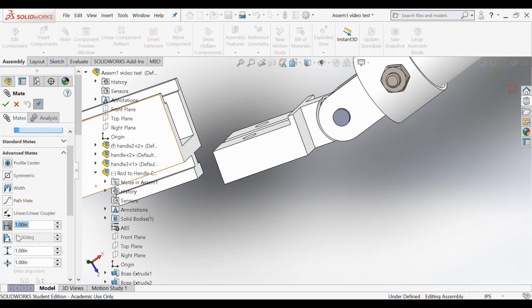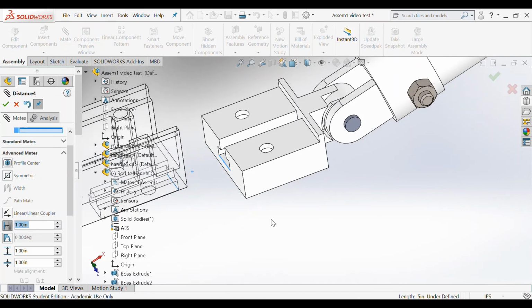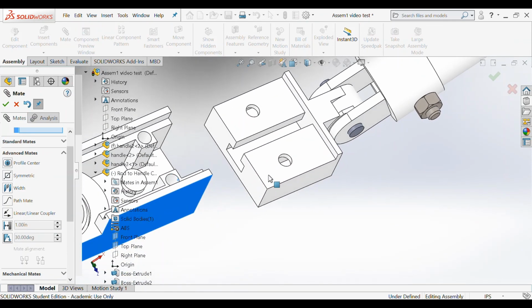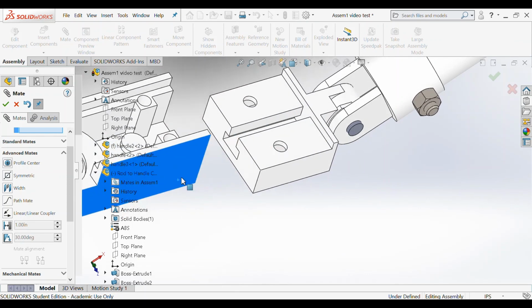So we're going to choose this guy right here, so the dimension, and we're going to limit the distance this edge right here can move from this edge right here. So this piece right here is 1.5 inches long, so we're going to go ahead and make our maximum distance 1.5 inches. And obviously when the attachment piece is fully pushed into the slot, this distance will be 0. As you can see, the piece won't go past this back face, but we can still detach it from the piece.